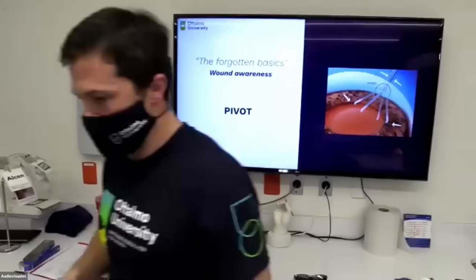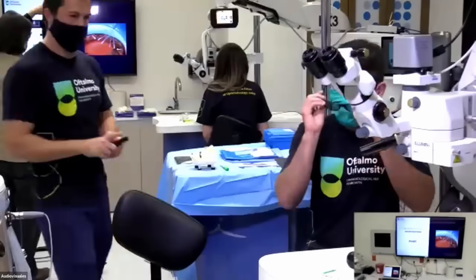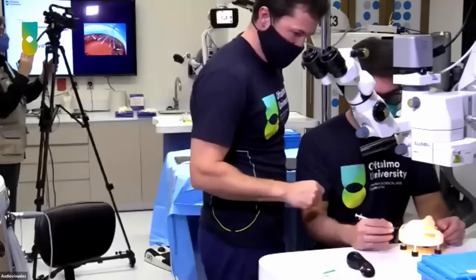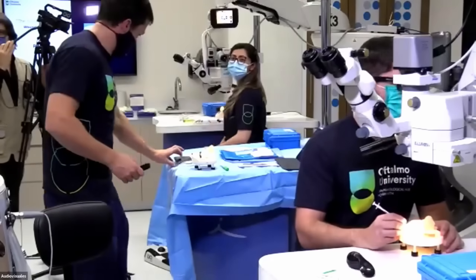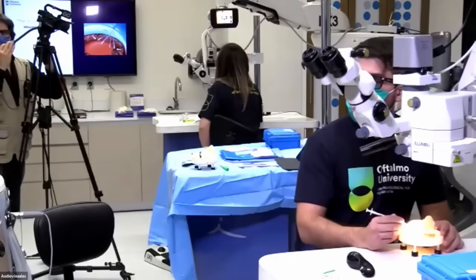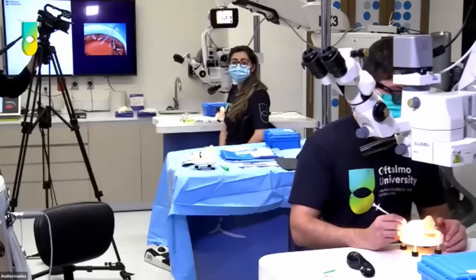Let's go to the other station. Yes, Ivo, I want to say something else. You have to choose an appropriate forceps. Many years ago, surgery was different. We many times go to operating rooms which don't have the appropriate equipment.